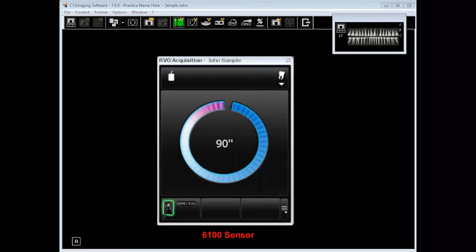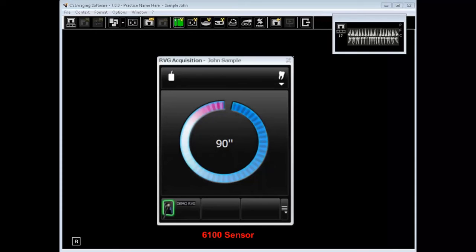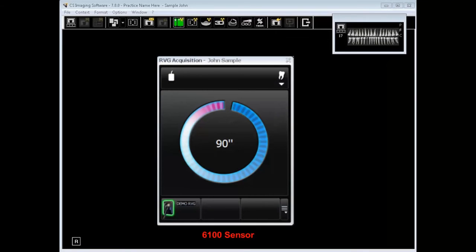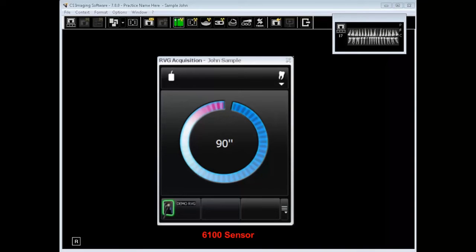RVG icon from the main toolbar to acquire a digital radiograph. In this case, the 6100 has been plugged in to the USB dock and it's been recognized by the software. The sensor must be activated prior to the radiation exposure for every image acquired. This can be done in the following ways. Press the remote button on the sensor that is pictured on this next slide. Click the RVG acquisition icon on the main toolbar or the function key F2. A 90 second timer is revealed. In the event multiple sensors are connected to the USB dock simultaneously, you must press the remote button on the sensor you want to use in order to activate. Otherwise, pressing F2 will only activate the last sensor used.